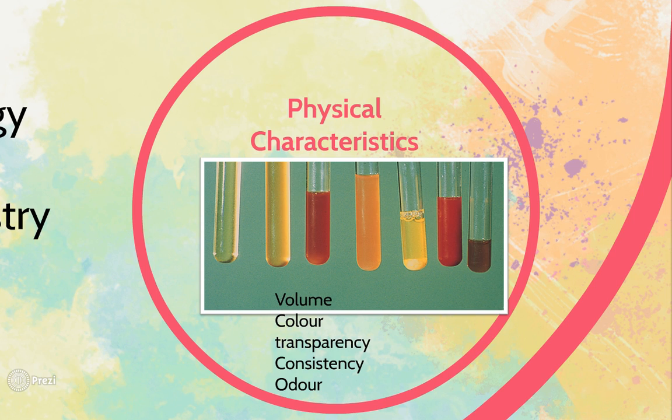So here we've got various colors that we're going to look at. From left to right, we have clear and colorless, typical of a transudate; yellow and slightly turbid, typical of a modified transudate; red and slightly turbid, often in part due to hemorrhage. Then we have orange and turbid, likely inflammatory fluid with some blood. Then we have sedimented fluid, and just note the thick pellet of cells in the bottom of the test tube after centrifugation. Then we have red and turbid, so bloody as a result of either hemorrhage or iatrogenic blood contamination.